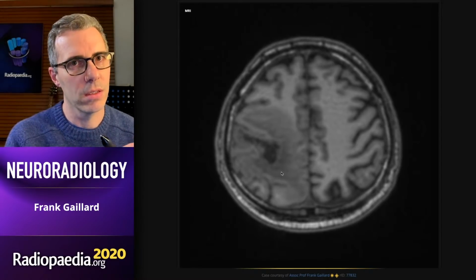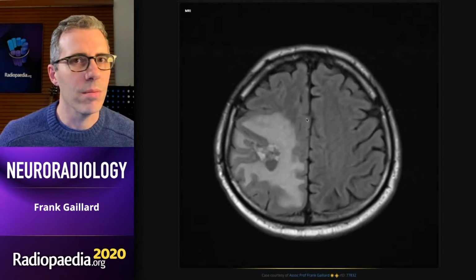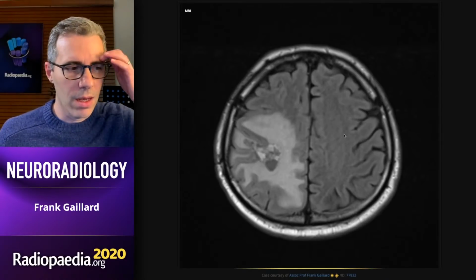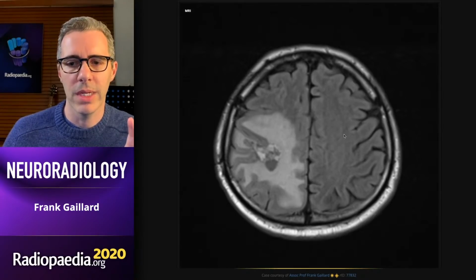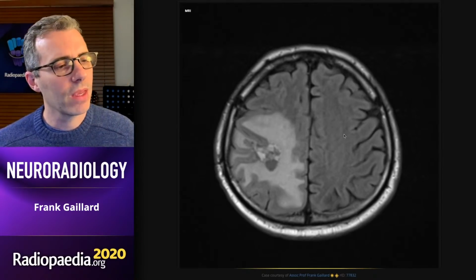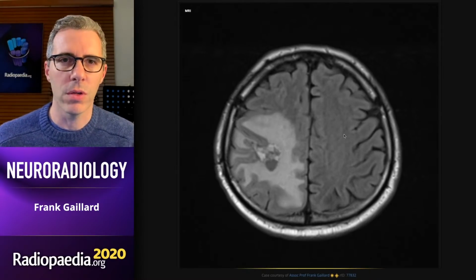So before this, the two sequences that you would use to assess tumor progression were just FLAIR and post-contrast. And they're still very important sequences that you want to look at, and look at multiple priors to get a sense of what's going on. But the presence of STUPP has meant that pseudo-progression is more of an issue. And what do we mean by pseudo-progression? Well, pseudo meaning not, or mimics progression. So it looks like the tumor's getting bigger, but it's actually not. In fact, not only is pseudo-progression not a bad thing, but it generally indicates a vigorous response to medical management. So it's a good thing. If you've got pseudo-progression, the last thing you really want to do is change therapy because it's working.